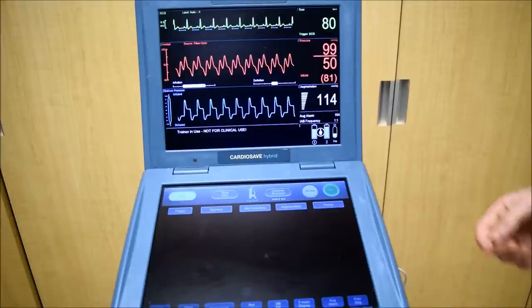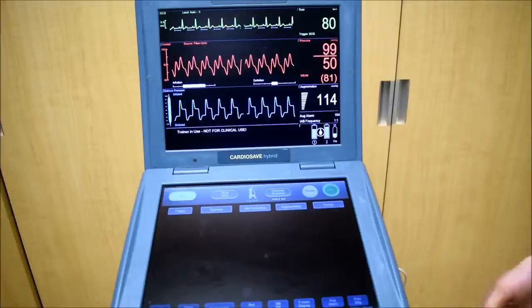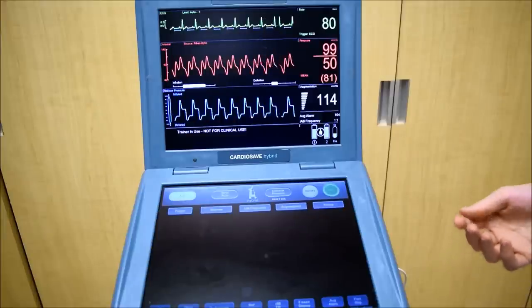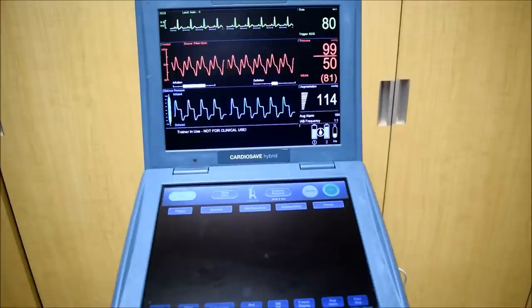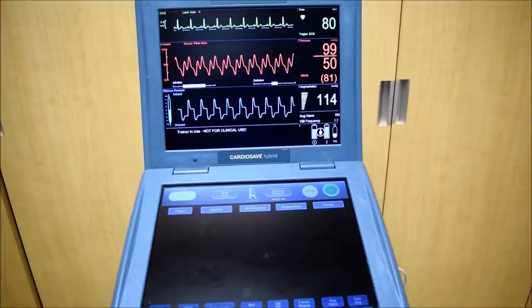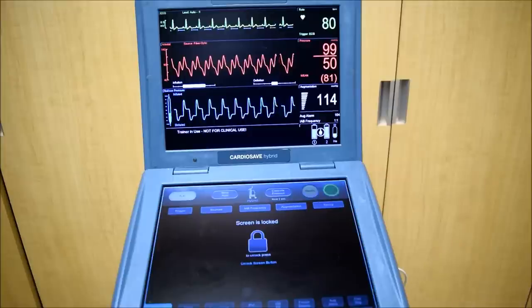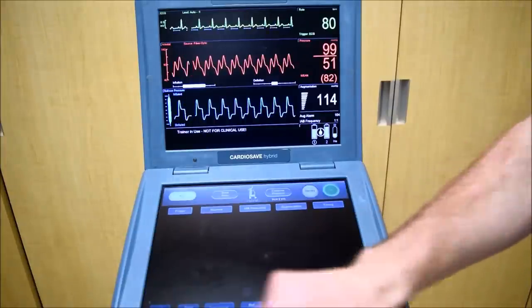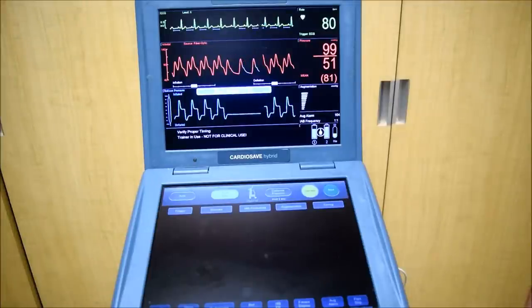Now that the balloon is on and our pressure transducer is zeroed, I'd like to time the balloon. You can do this one of two ways. You can do it in auto mode, which it's currently in. This is really nice for time-sensitive situations — if you need the balloon to get going quickly, this is the setting to use. However, if you want something more accurate, we can time it ourselves in semi-auto.